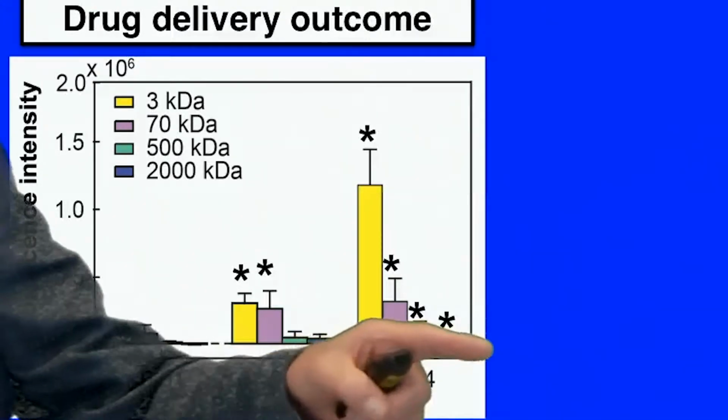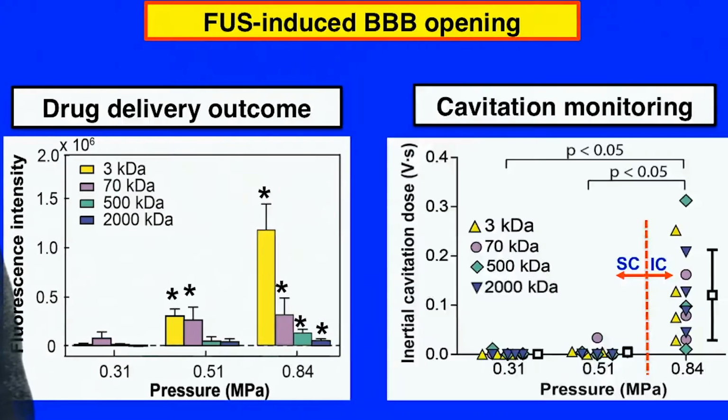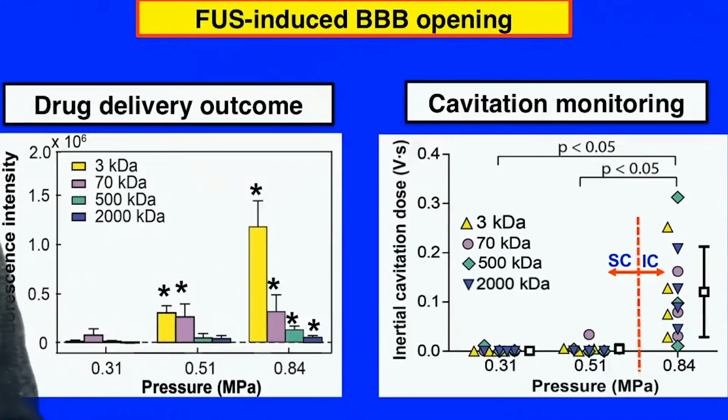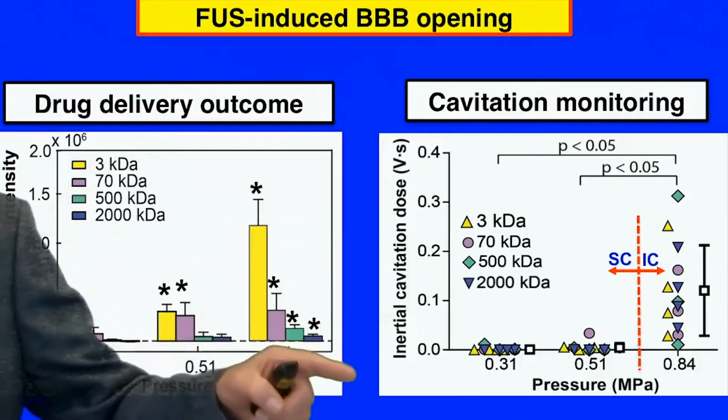And these data show that at different acoustic pressures, you've got different inputs or translations of these drugs into the brain.